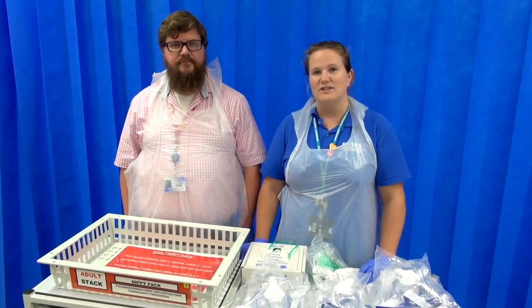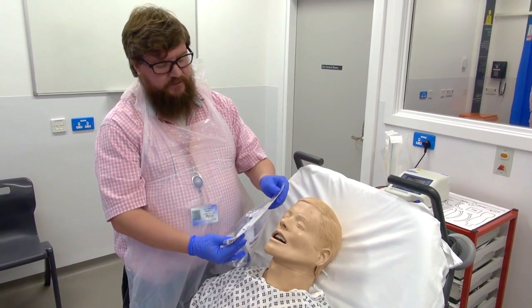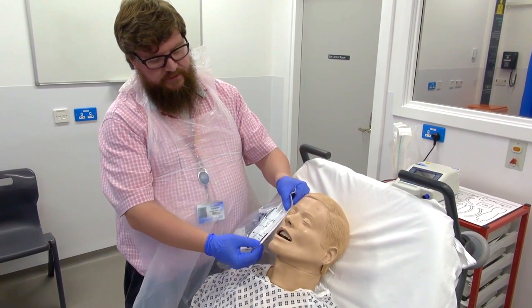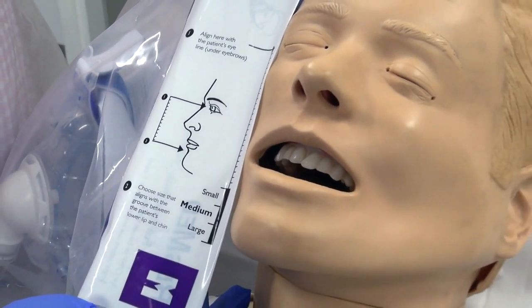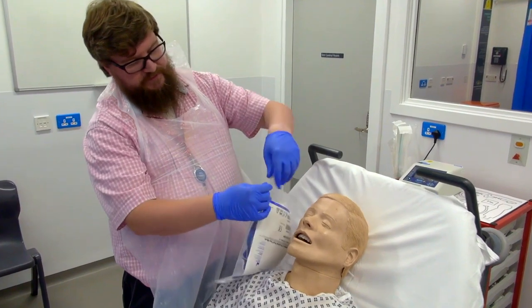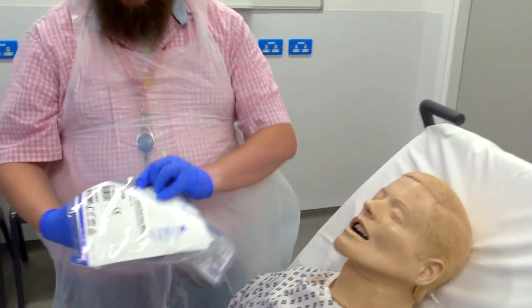Now we'll go through how to size the mask for the patient. When you're sizing up the mask, you want to size up level with the eye and the lower part of the lip. As you can see on this mask, it's a medium. So let's open it — pull across the perforation and take all the contents out.